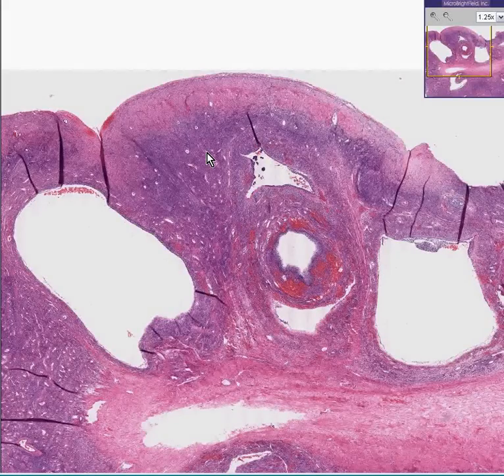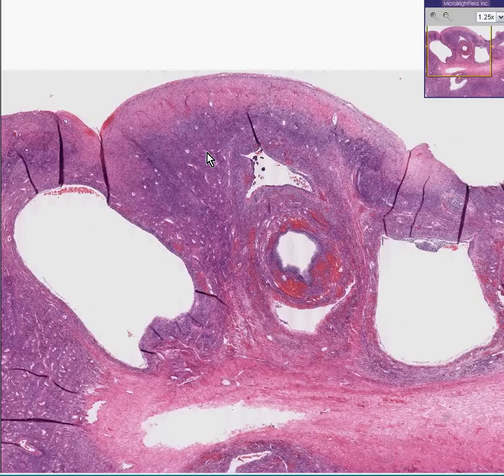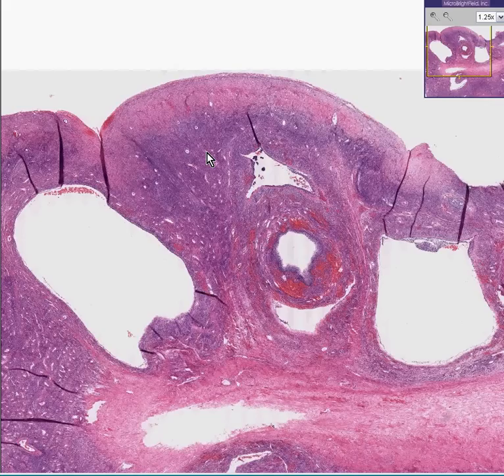It is often really hard to find any type of ovary that doesn't have some little type of cyst in it. There are all kinds of cysts resulting from all kinds of situations, whether they're functional or non-functional, whether they're epithelial, whether they're germ cells, whether they're Mullerian. Cysts are an integral part of ovaries. In fact, in the normal development of a follicle, you have a cystic configuration to some of the more mature or Graafian-type follicles, in which you see the beginning of an antrum.